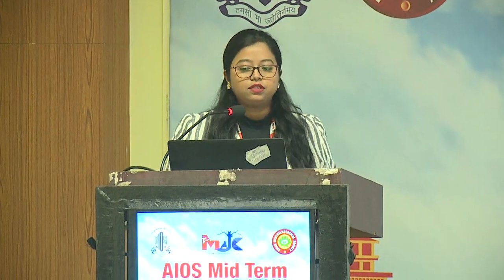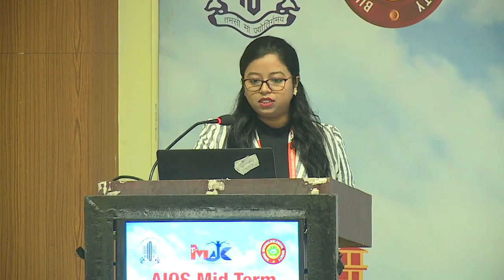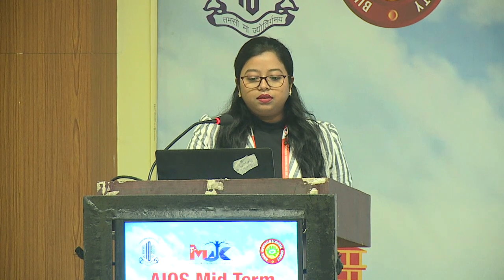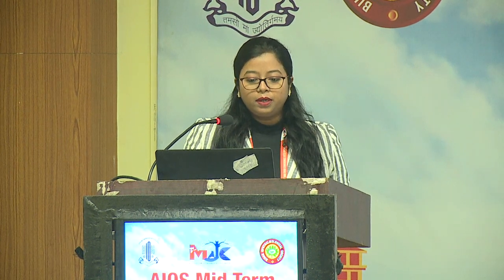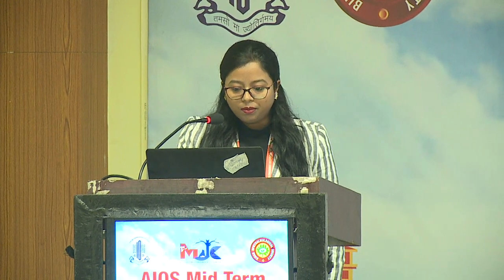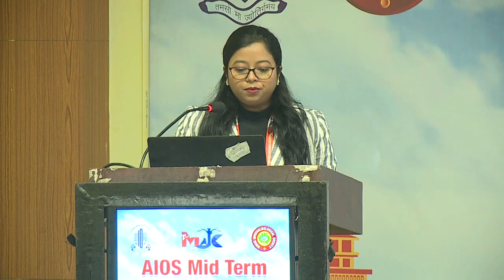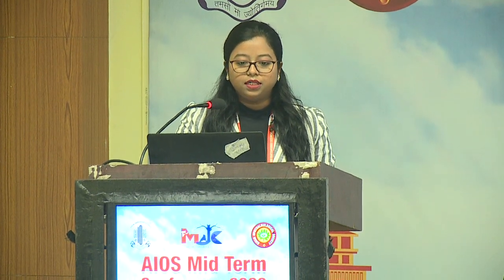We'll discuss the prevalence of primary angle closure disease, and assessment with the Van Herrick test, gonioscopy, and ASOCT. There are two major forms of glaucoma: open angle glaucoma and angle closure glaucoma. The high prevalence of occludable angles and primary angle closure glaucoma in people of East Asian descent suggests that all adults attending OPD for an ophthalmological assessment must have an angle assessment.